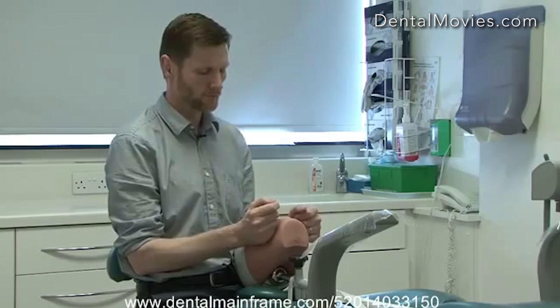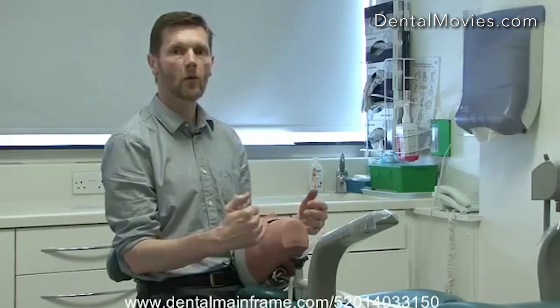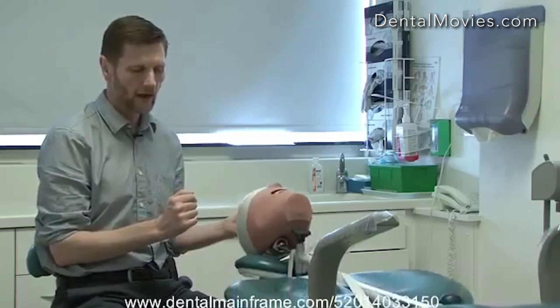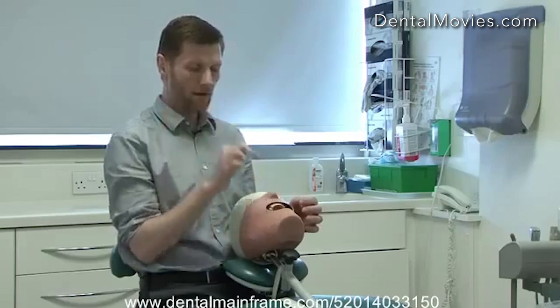The 11 o'clock position is the normal position we will work in for most operative procedures. Sometimes we'll need to adjust the chair according to what we're doing — notably if we're working on the lower front teeth. In these situations we can have the patient more upright, which gives us direct vision. I want to work with my forearms slightly raised, elbows tucked in, and shoulders back and relaxed, so I can see directly onto the lower front teeth without needing to use a mirror.